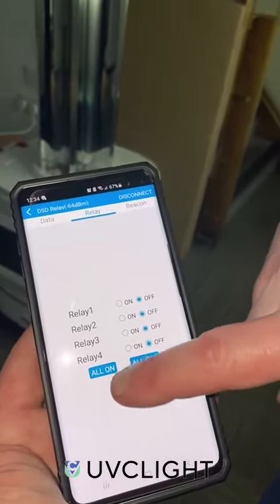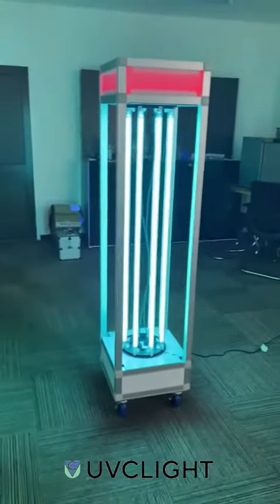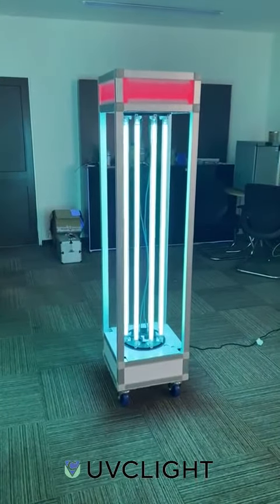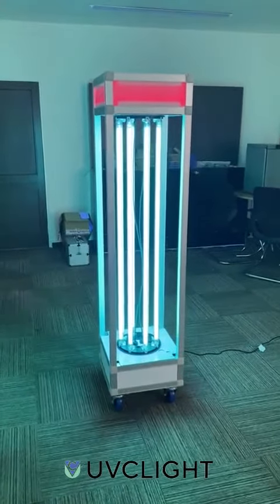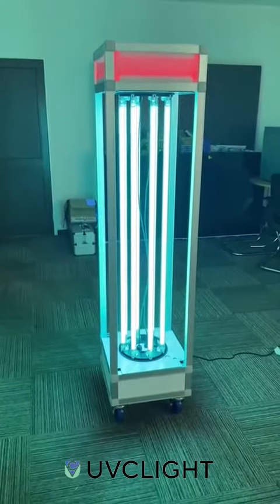You press all on and all the bulbs will go on. You can do it at a safe distance to make sure you are safe, and the UVC disinfection trolley will be able to do its process.